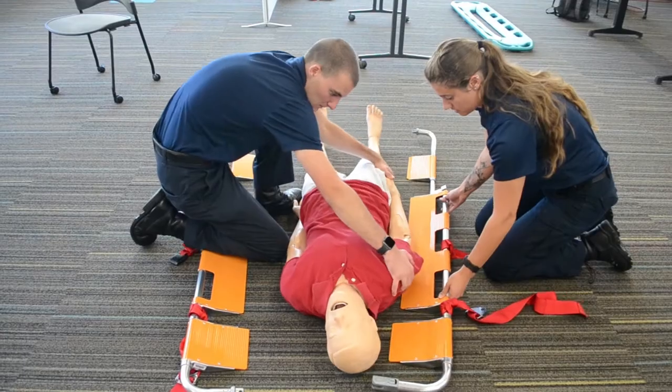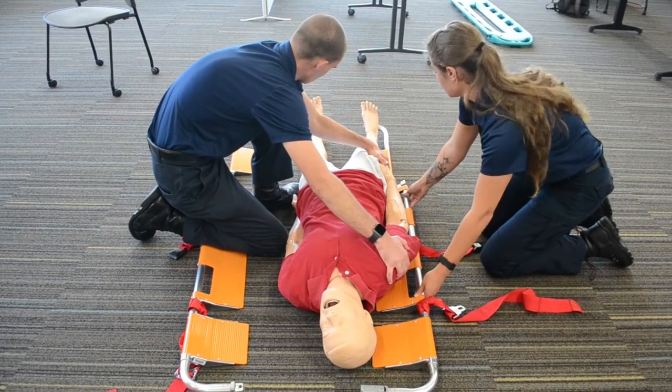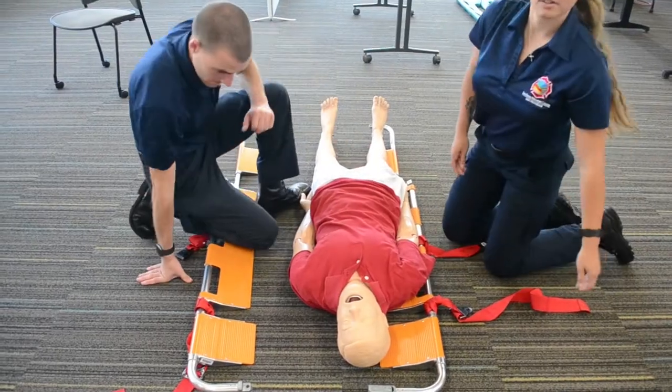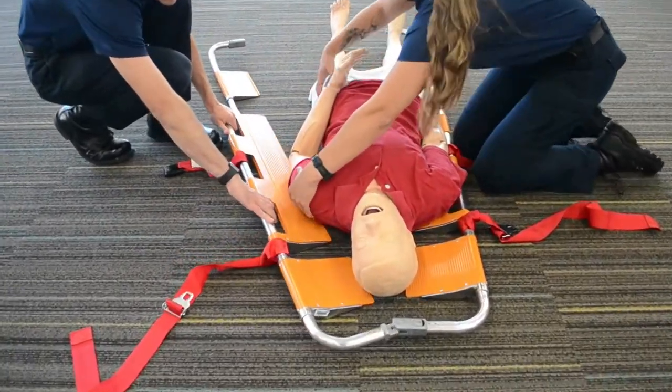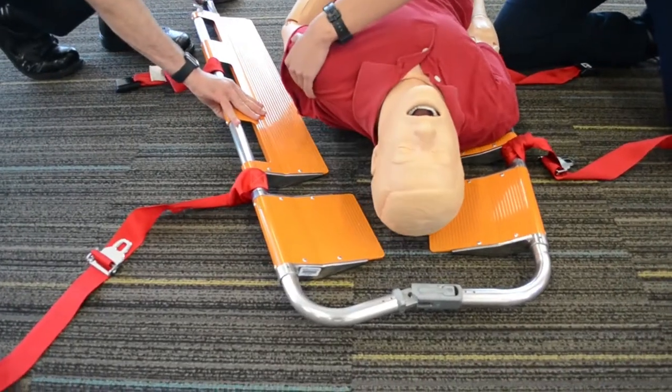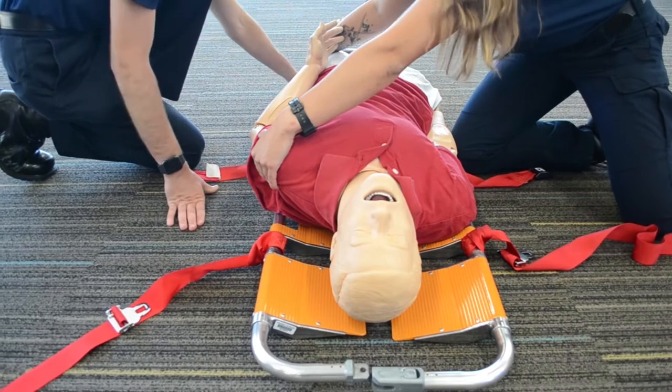One two three — getting it just a little bit under. Down, one two three. Now we're gonna do the same thing for the other side. One two three. One two three.